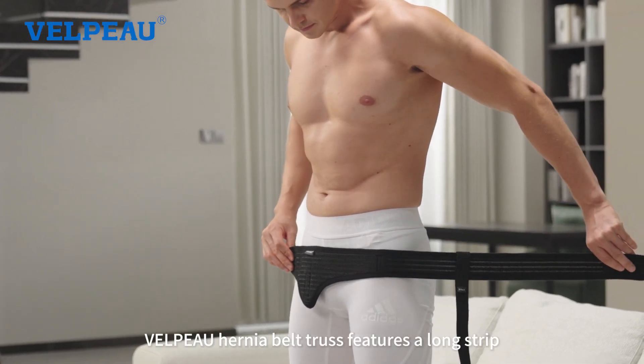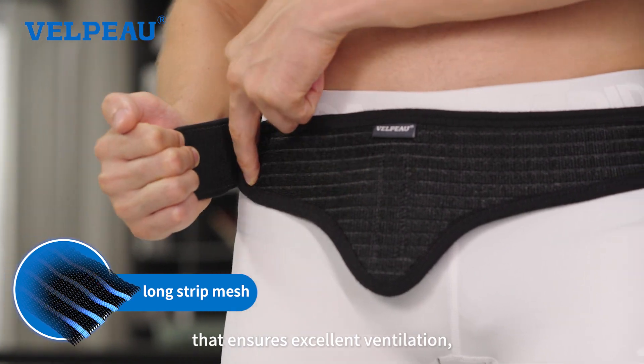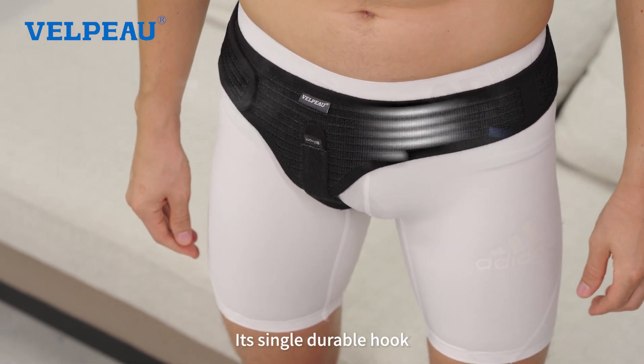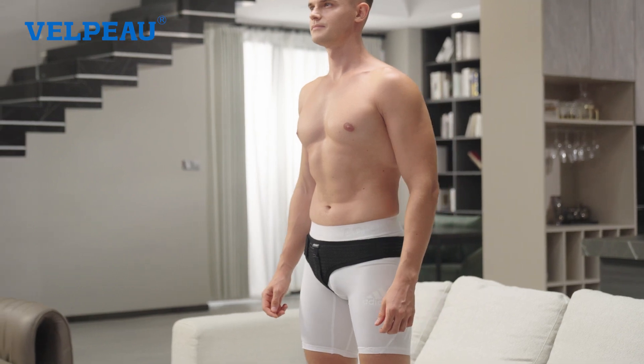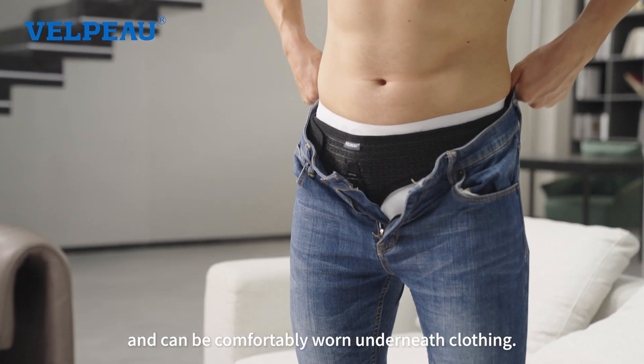The VELPEAU Hernia Belt Truss features a long strip of breathable mesh fabric that ensures excellent ventilation, keeping you cool and comfortable. Its single durable hook and loop fastener remains secure even after continuous use. This product is free of rigid components and can be comfortably worn underneath clothing.